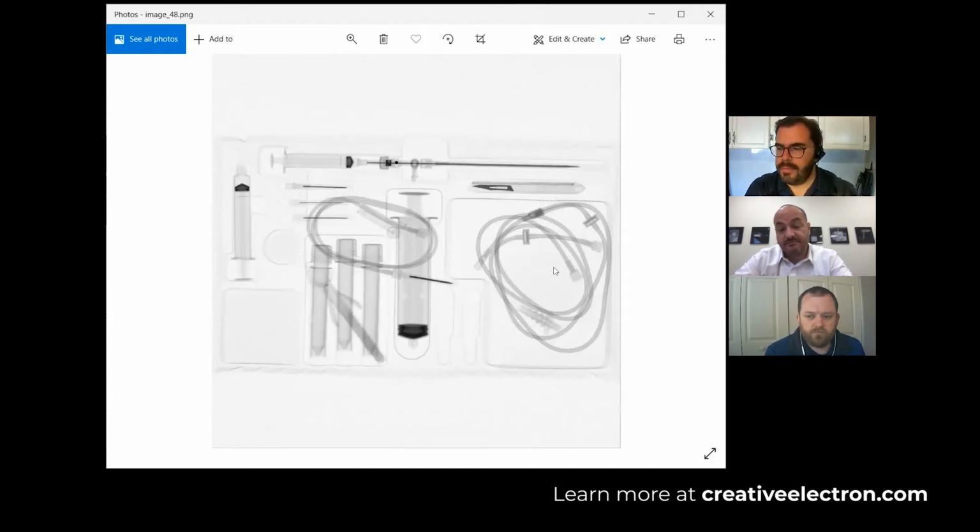Yeah. Now, if that's the question, it's a machine vision path and pretty straightforward. We're pretty much done. Now, if the question is, is that needle in that package, anywhere in the package, that becomes an exponentially more complicated problem that machine vision can't answer. Especially if the needle is going to overlap with the tubing or be on top of the syringe. That becomes a very complicated problem that, again, machine vision can't answer.